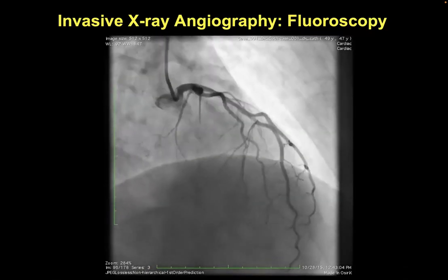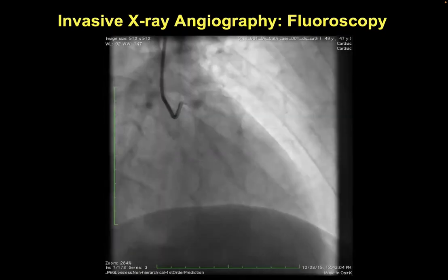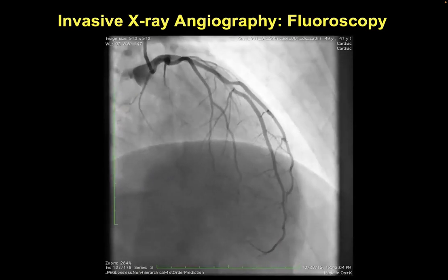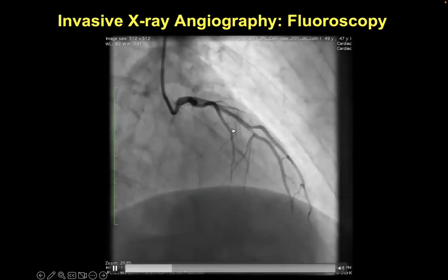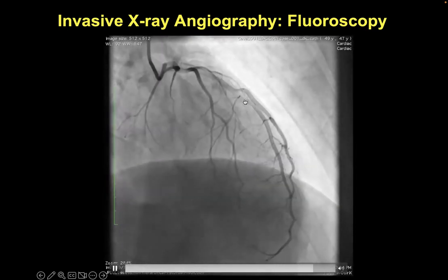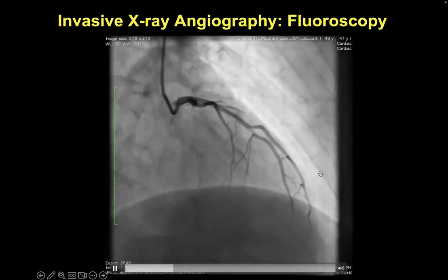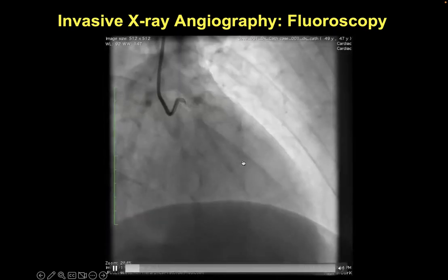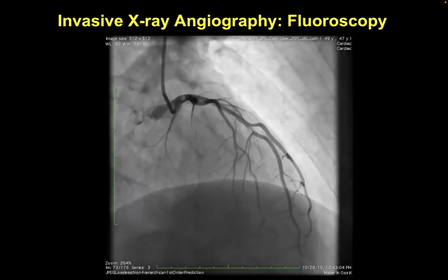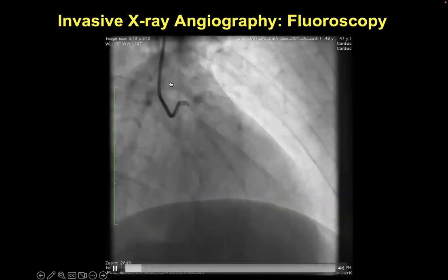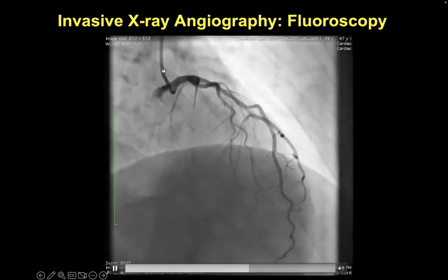Here are the pictures that come out — spectacular. When you look at the size of the vessels visible after injecting contrast into the coronary, it's pretty detailed. You can also appreciate the rate at which contrast travels from the injection site to the most distal part of the vessel. This vessel — the LAD — filled very quickly, suggesting no flow restriction. This is normally done at about 15 frames per second, sometimes higher for greater temporal resolution. The catheter has a specific shape to engage the root of the coronary artery most easily once it's come down the ascending aorta.